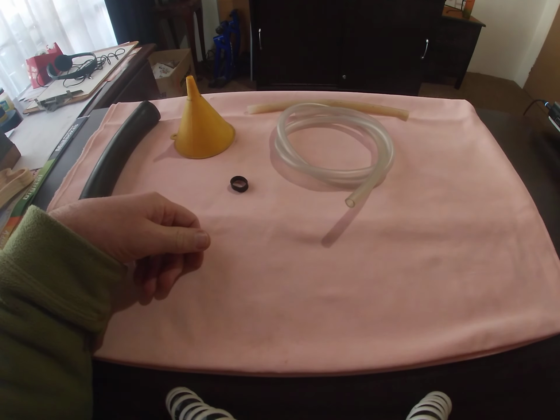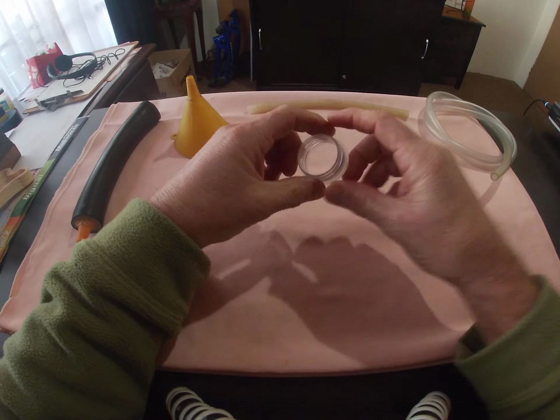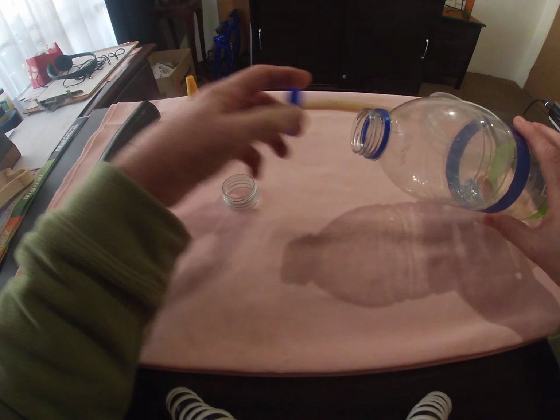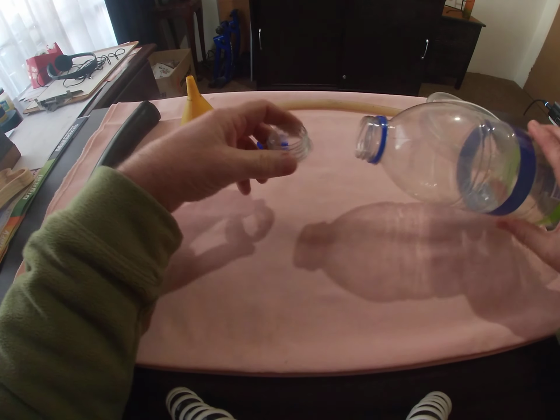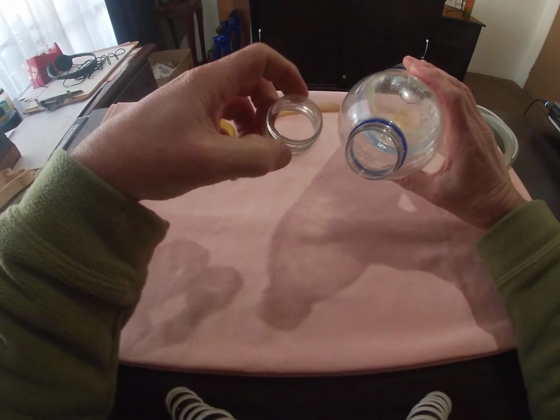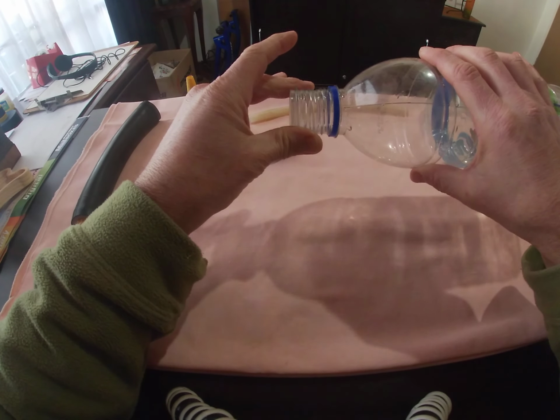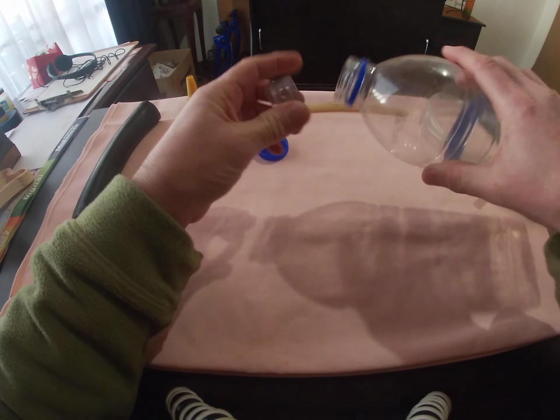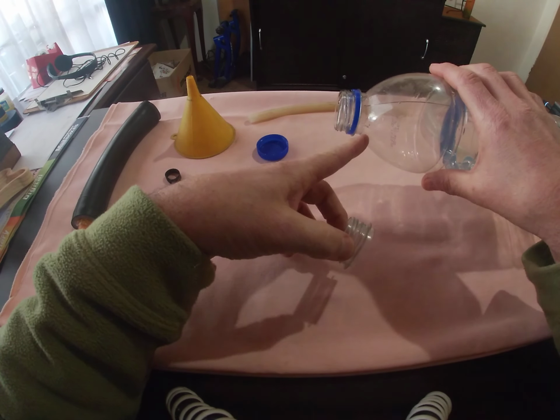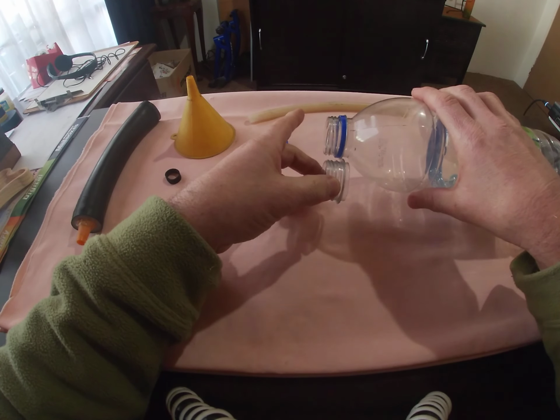And then you're going to make yourself a ring like this by looking for an appropriate cool drink bottle. This is a juice bottle, and you'll see this size is very close. I found this on a smaller juice bottle, but it's more or less the same size. It looks like it's actually exactly the same size. You cut the top of it off, and you only need to leave a small little rim at the bottom, like that.